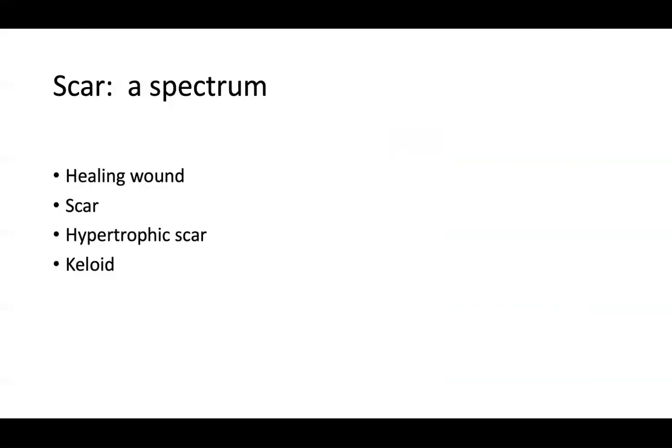All right, moving on to a scar. So we had a joke in fellowship that we would often look at things and think, oh, it could be something interesting. And then we realize, you know what? It's just a scar. So scars can be trickier than most people think sometimes. And clinically, scars can be pink papules that look like basal cells or that look like amelanotic melanomas. And it's just a scar. But you wouldn't know that unless you did a biopsy, and you definitely need to be prepared to be able to diagnose a scar in real life.